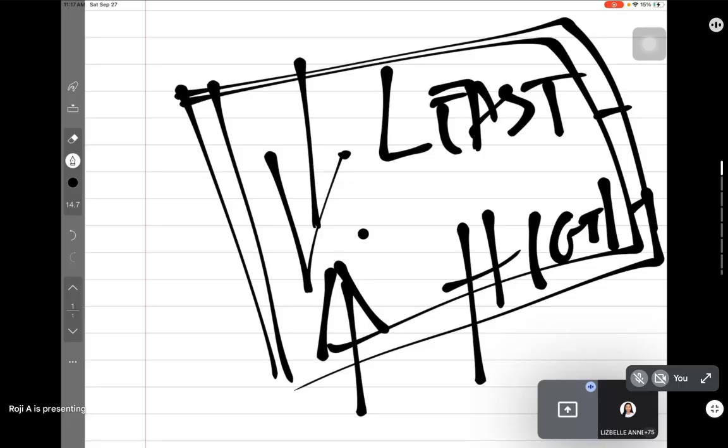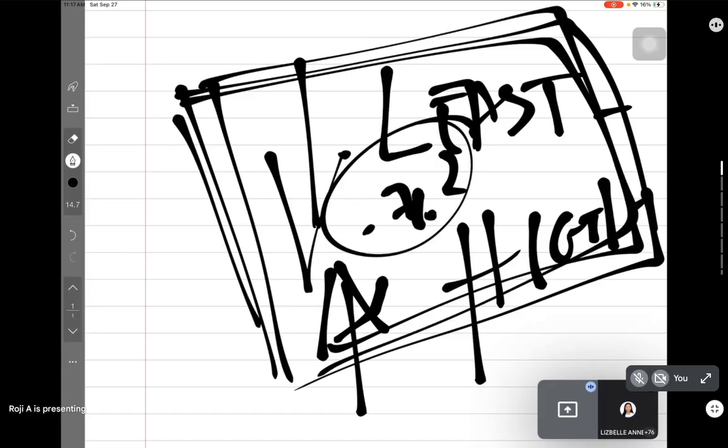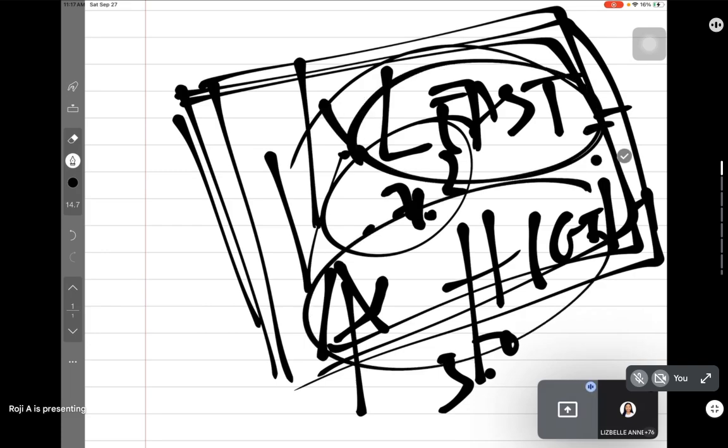Should I use 75 over 50? Because it's 72, when in doubt, I always use this. So what should I give? I would always give the 50 because I would always go for the least. Does that make sense to you? Okay, Doc, thank you. All right. When in doubt, always give the least minus and highest plus.